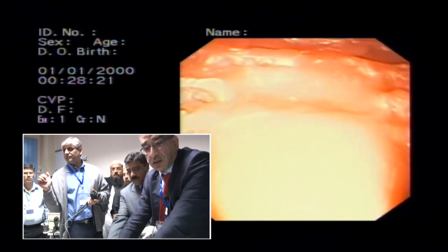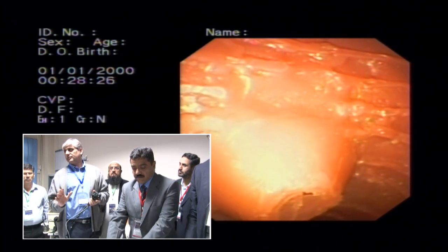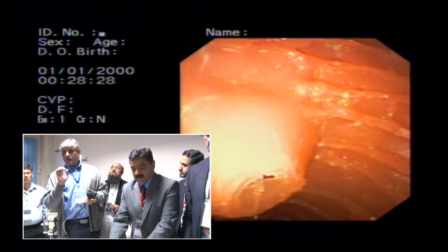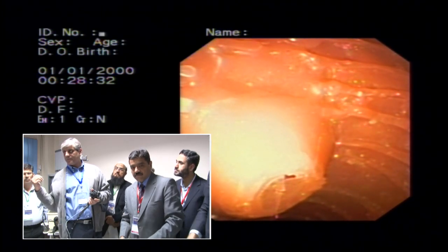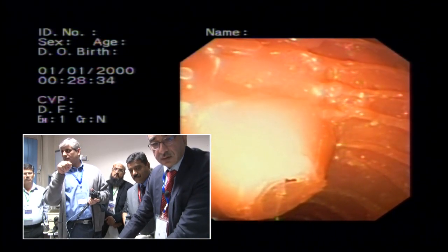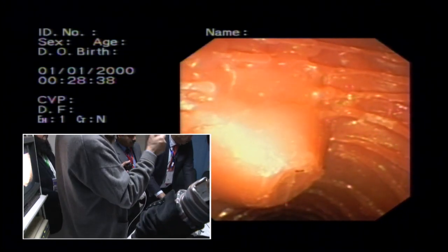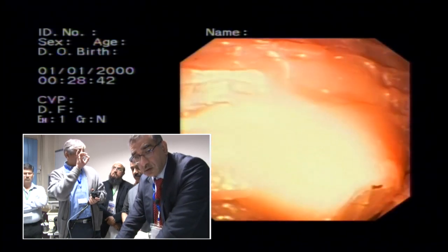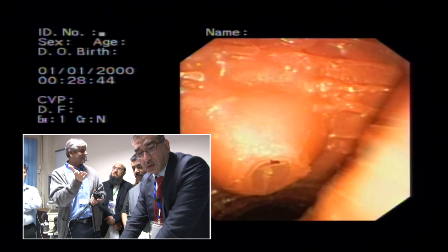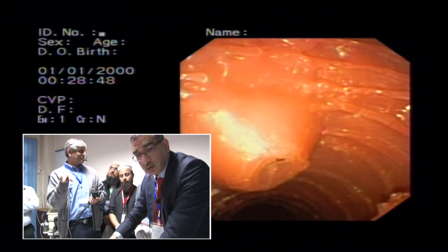So this is what happens. He's absolutely right. Anybody who's doing regular ERCPs and doing good ERCPs, without realizing it, while he's waiting for everything, is observing where he's going to go. Once you've sorted the position out, you're looking at the ampulla and seeing where to go. Usually it's one place, planning it. Because you need to know, sometimes, like you say.